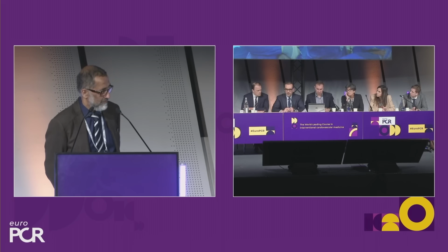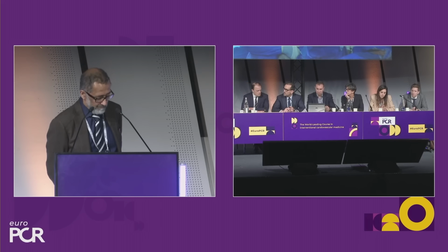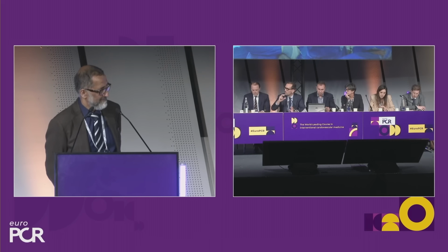You demonstrate during this deployment that you didn't need to pace to have a stable valve, especially during the inflow opening. Do you have any criteria to decide whether you need to pace with a navigator or not, depending on the heart rate, on any kind of yo-yo movement, on an amount of AR? Or you just try first like that, and if it's unstable, you pace?